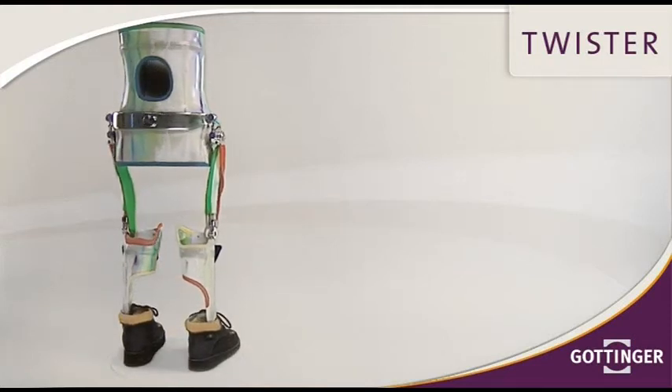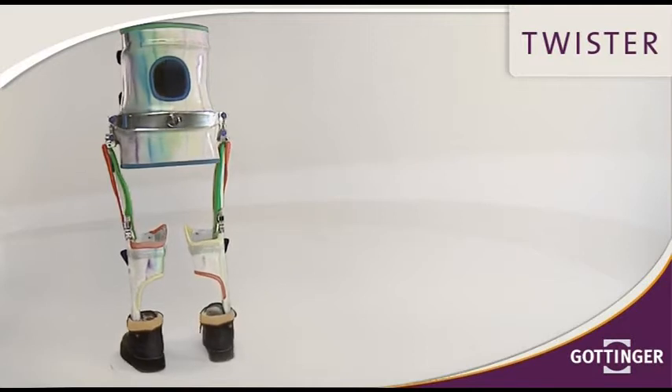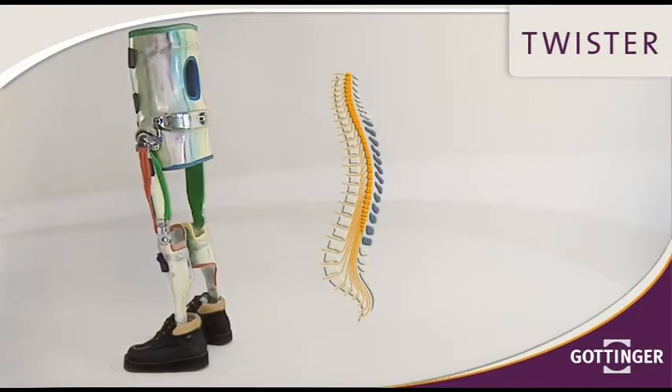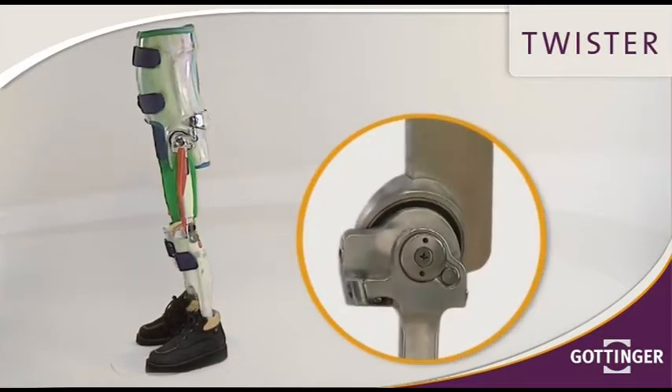The Twister is a hip joint system with a reciprocal circular gait. It provides the orthosis with maximum movement span. Its indicated application lies in the area of lesions between L2 and T5.